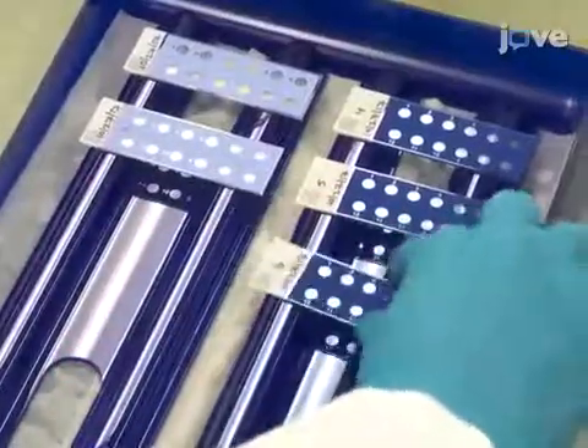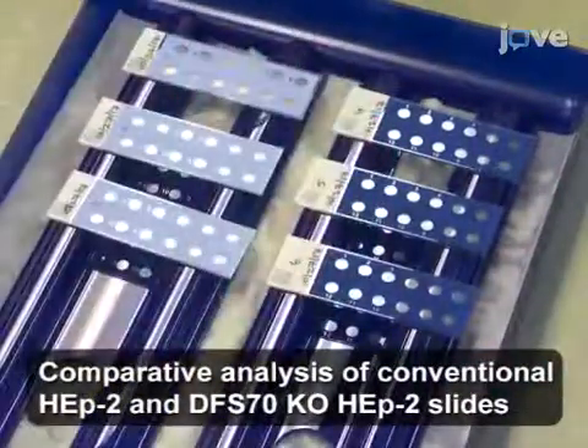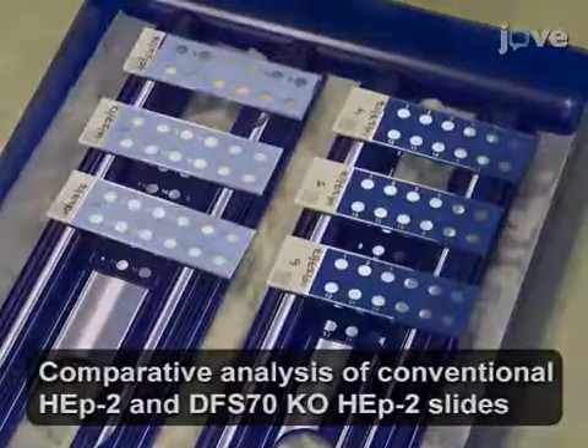Label the slides and place them in an incubation chamber that has been lined with moistened paper towels to prevent drying of the slides during sample and conjugation.